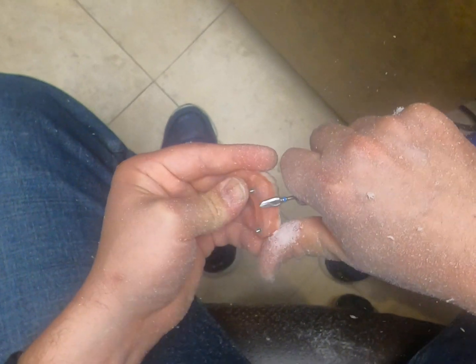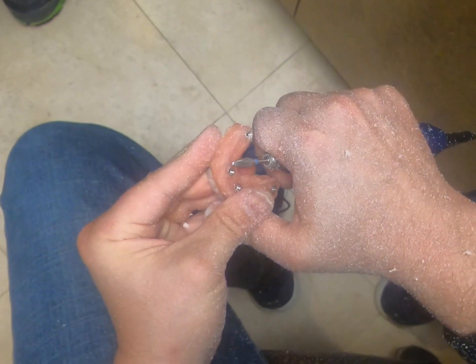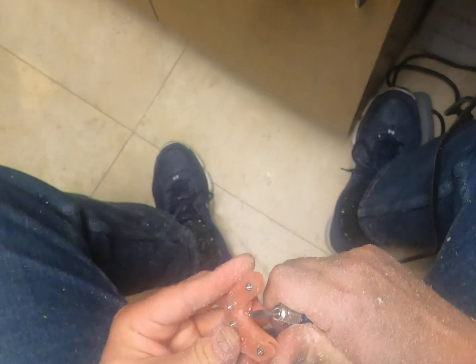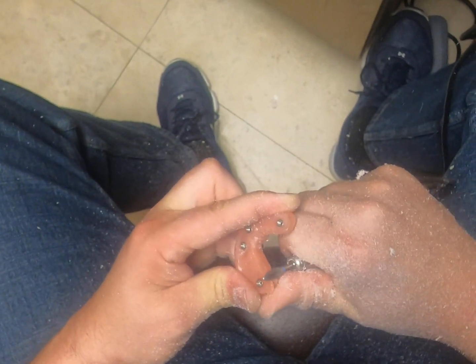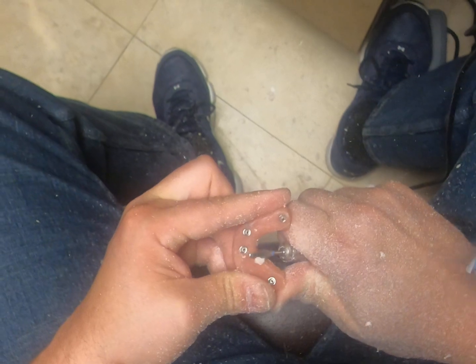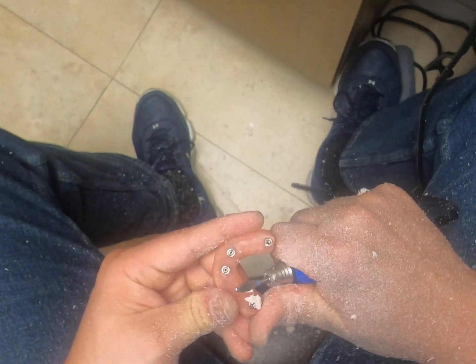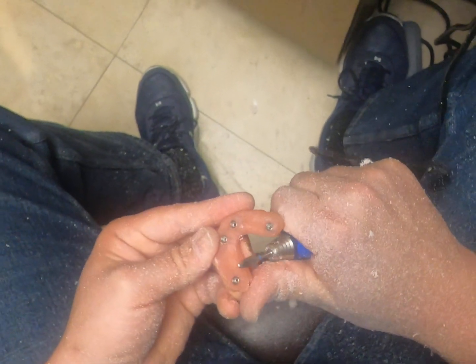Essentially just doing it like that. Are you doing a hand polishing thing? Hand polish — okay. I thought that the multi-unit abutments had a sharp ledge, but that's only for the narrow platform. We were using regular platform — so I forgot about that.